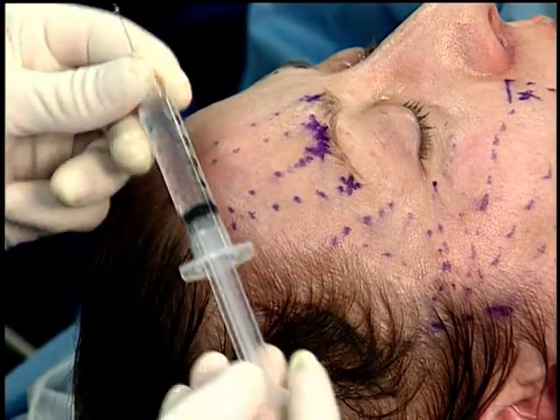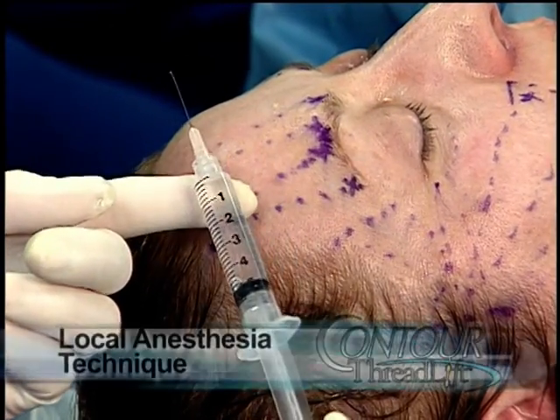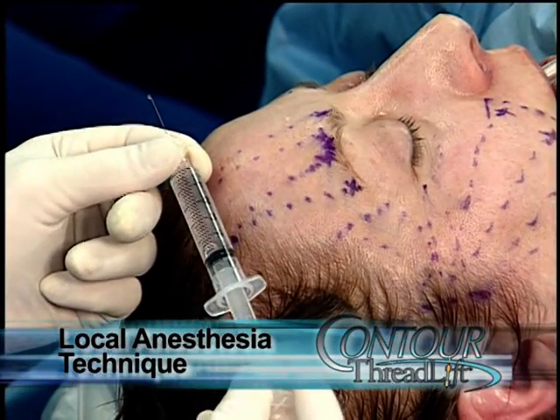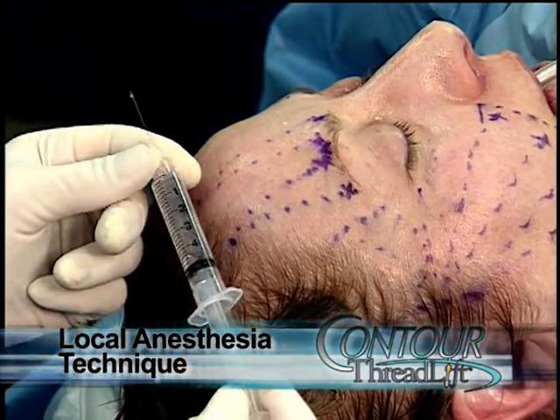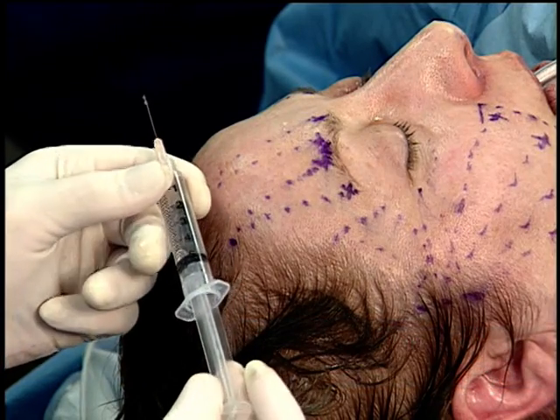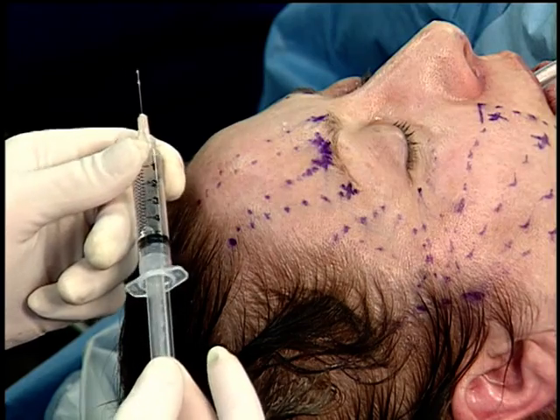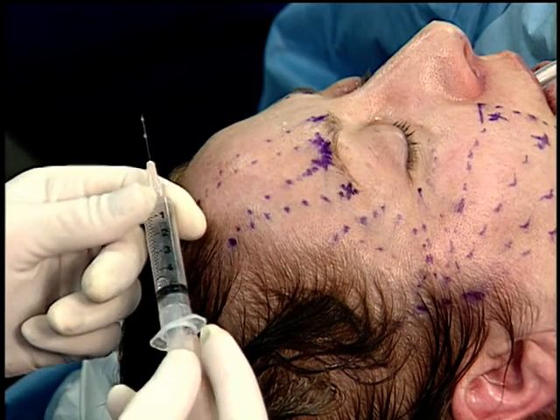This is the syringe and needle that I use for the initial intradermal anesthesia. I use a 5 cc syringe. The reason for a 5 cc syringe is that I don't want to create a xylocaine toxicity or lidocaine toxicity. And this is one of the biggest risks of a local anesthetic procedure: too much lidocaine is used.